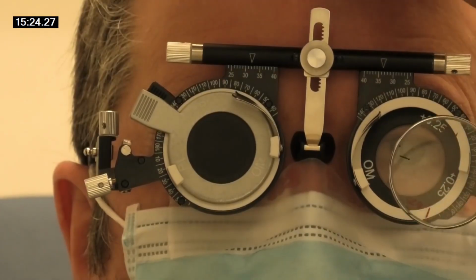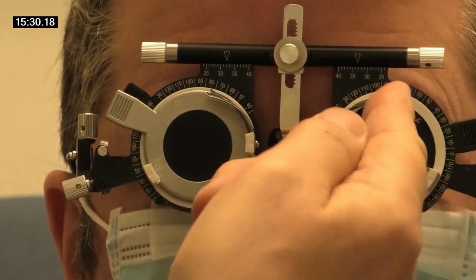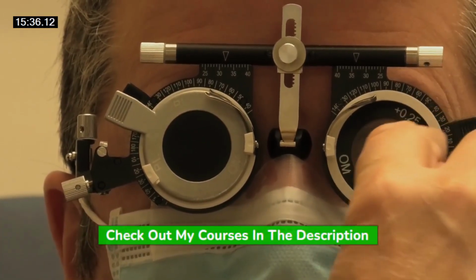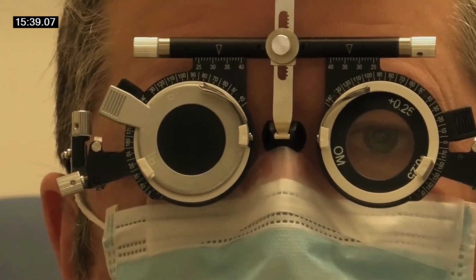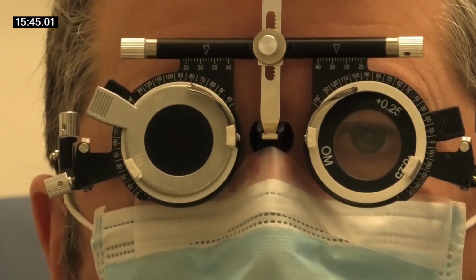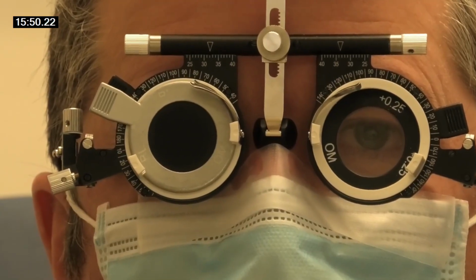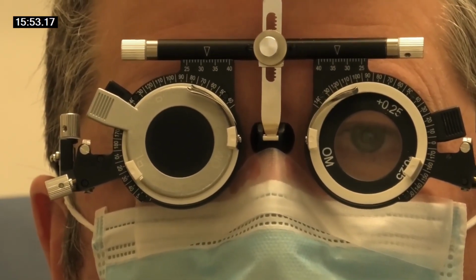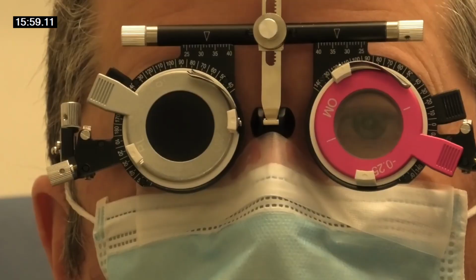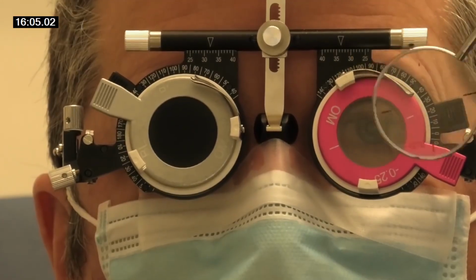So you've got to put. So I'll just take that away a minute. He likes this one, 0, and he also likes this one as well, doesn't he? So you've got to put one in between. Okay. Yeah. So like 25? But put it in at a nice round figure, 20, because later on, if he has got cylinder, you don't really want to be on 25. You want to be on 20, because 20 you can change it by 4. You can change it by 20s easily. Putting in at 5, even 25, is not necessarily good. That's it. Good. So now we go for power because it's only a small cylinder and he's got very good vision, doesn't he? Yeah.